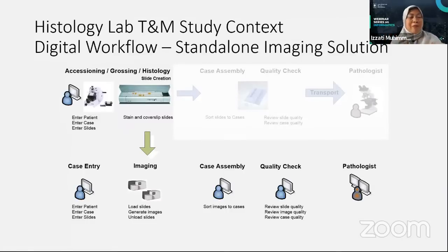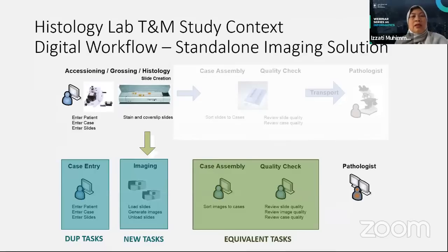So 500 patients' slides need to be read in a day. That's very tiring, but you have to focus to read the cells under the microscope.